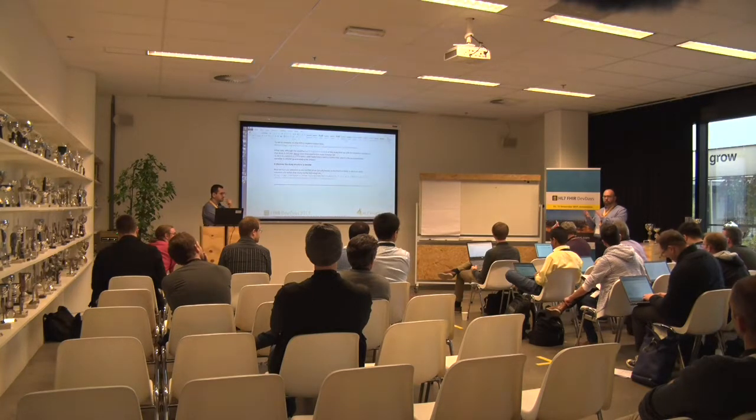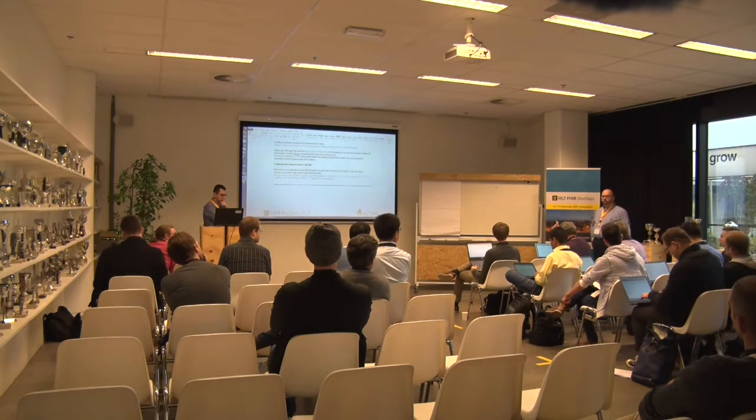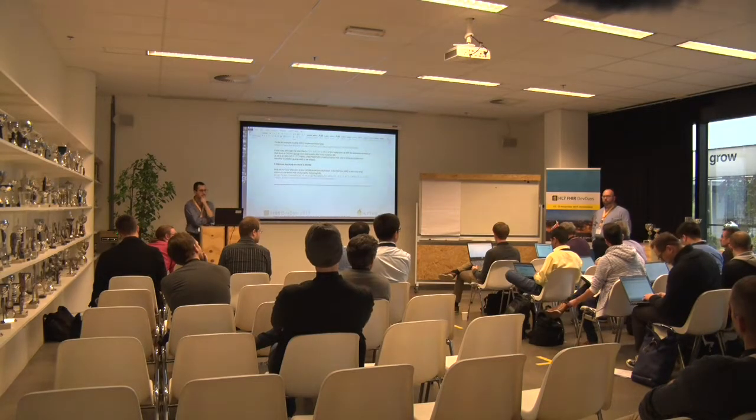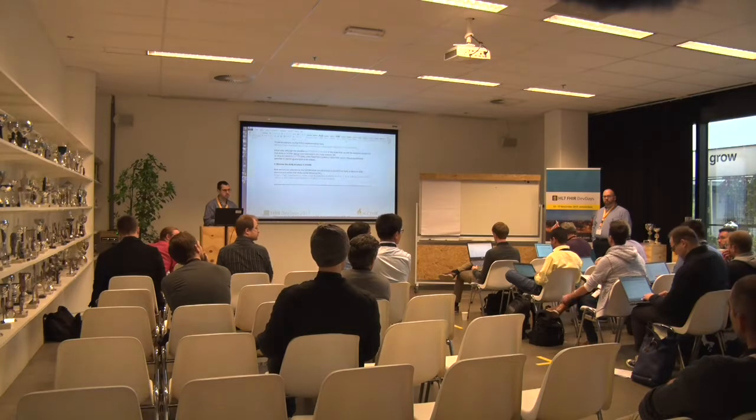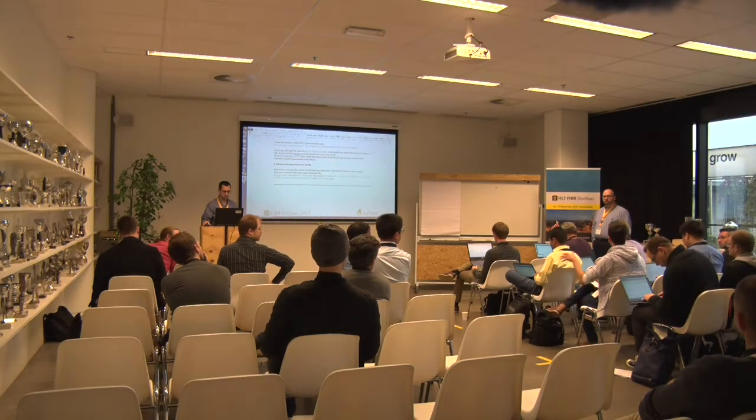And so that pointer back would be difficult to describe because it's a little bit more dynamic. So you probably wouldn't see that. But you can always search back and get the information if you knew where the FHIR server was. So would you think that kind of like a gateway where you abstract all this FHIR and DICOM thing will be helpful?